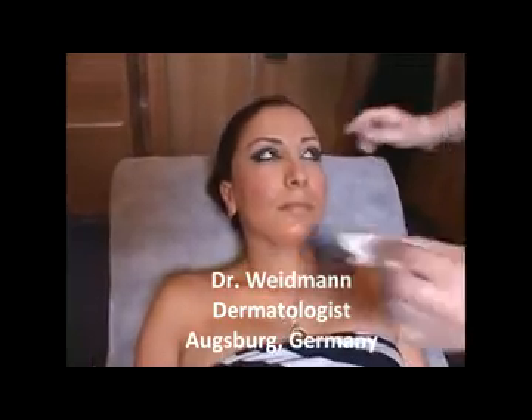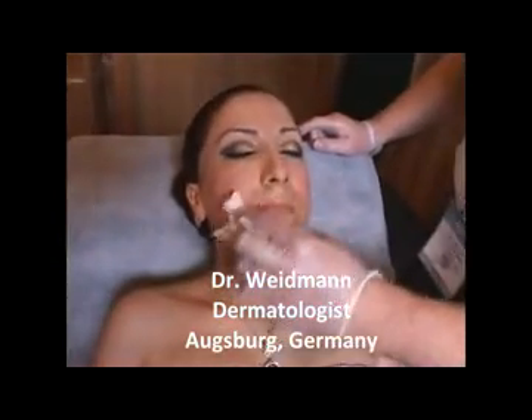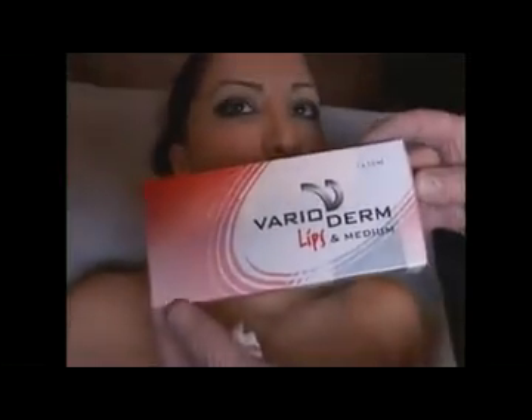We have a lady with very nice lips, so normally I would do here only a little correction. The product is the Varioderm Lips Medium — this is BDDE cross-linked material, which stands out from the range because all the other products are DVS cross-linking. The cross-linking rate, even with BDDE, is very high — about 30 percent, which is the highest level you can get with BDDE.